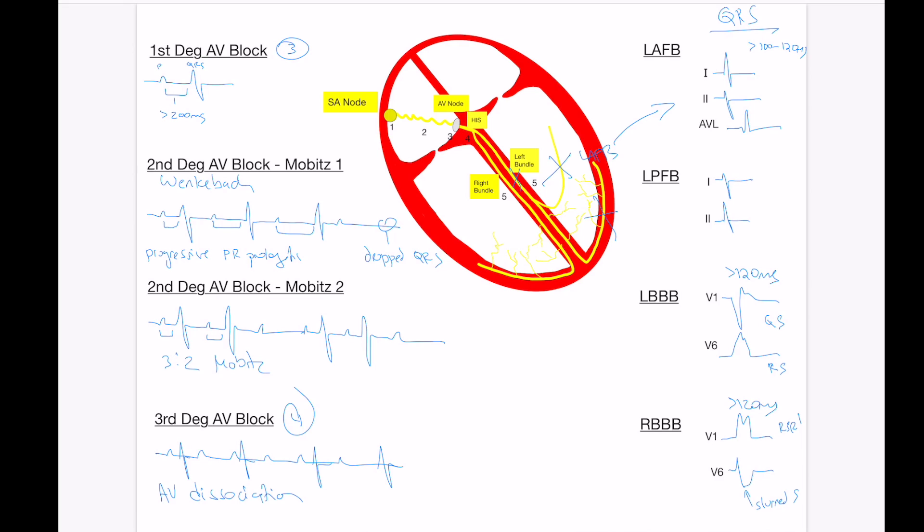So again, for these two bundles, left and right, if you notice it's greater than 120 milliseconds, look at these two leads, and you'll be able to figure this out.